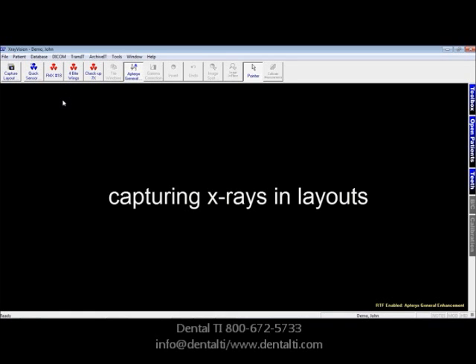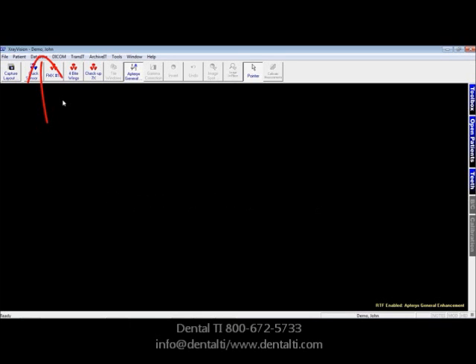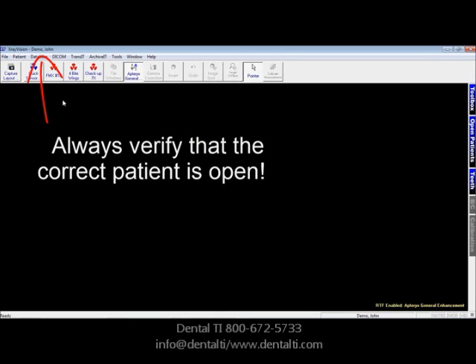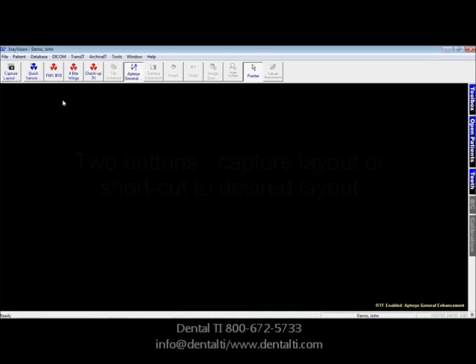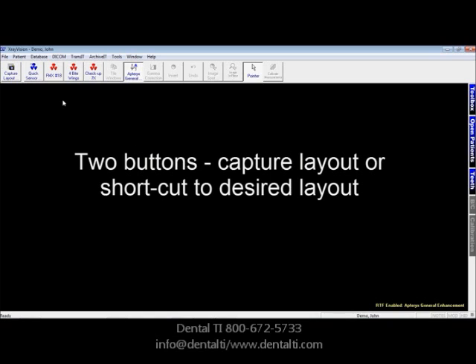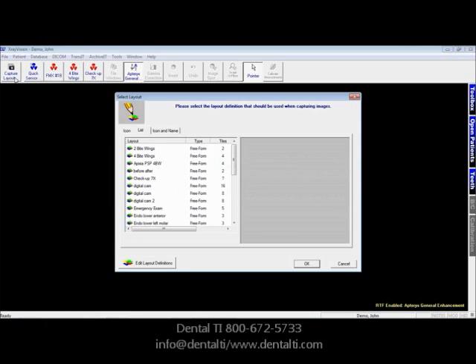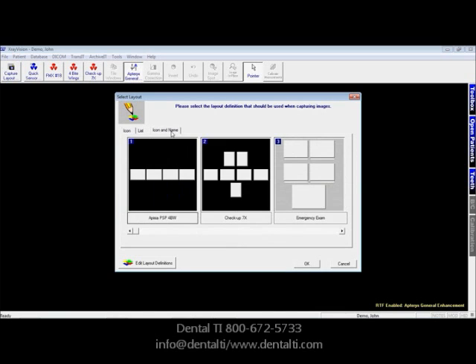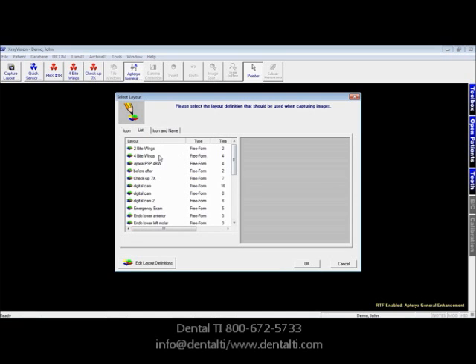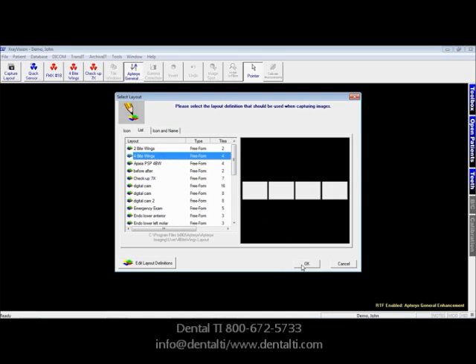Capturing images into layouts — organized X-ray series like four bite wings or a full mouth series of 18 X-rays — is very easy in X-Ray Vision. There are two ways to accomplish layout capture. One is to click the Capture Layout icon, where it opens your choice of layouts. You'll notice you have list view, icon view, and icon and name options. In list view, you could choose four bite wings and click OK.